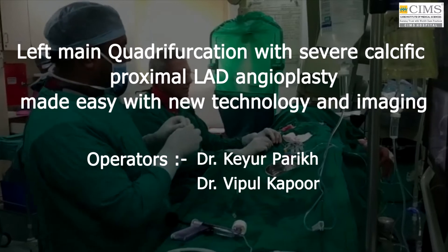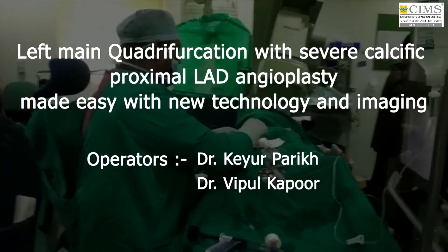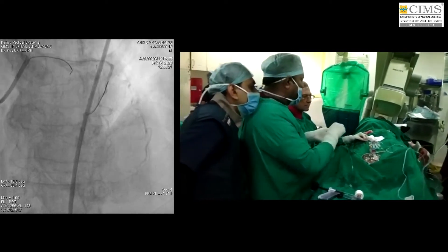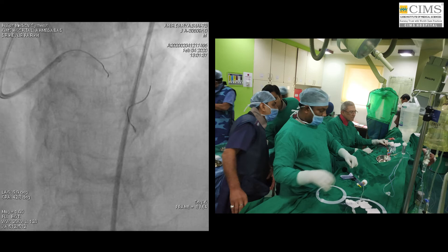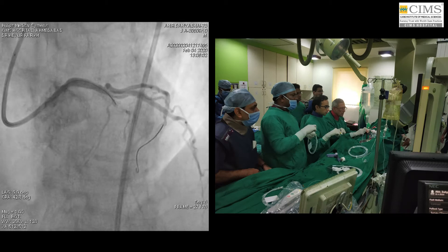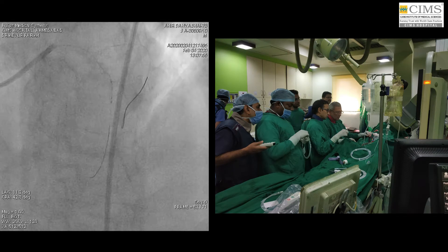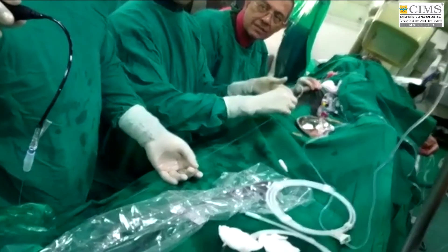Angiography done at the outside hospital showed a patent right coronary artery but the LAD was diseased. On repeat angiography here, the LAD was totally re-occluded. The patient was very unstable. We started with a pilot wire and crossed the lesion with a pilot 50 hydrophilic wire, which was slowly able to cross. There is heavy calcification in the proximal LAD as well as the left main. Once the wire was crossed, using 1.5 and 2.0 balloons we created a small channel. We then decided to use IVL intravascular lithotripsy.